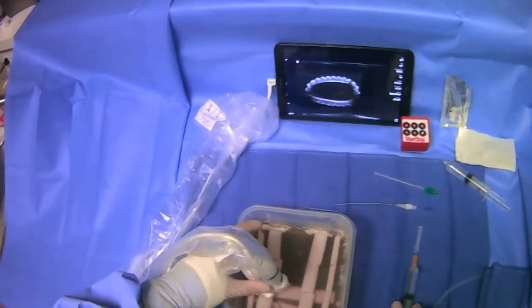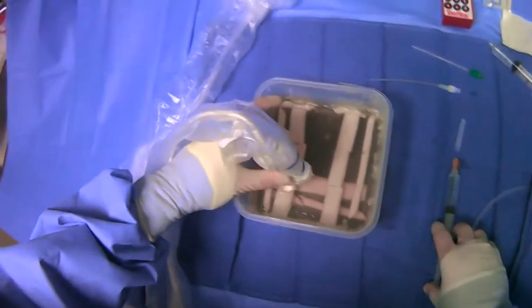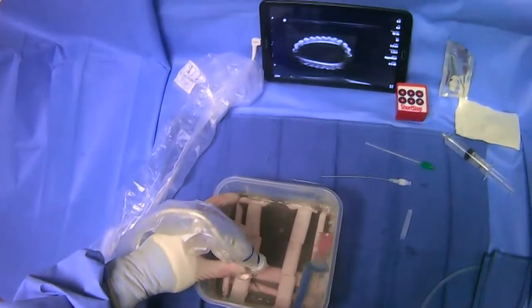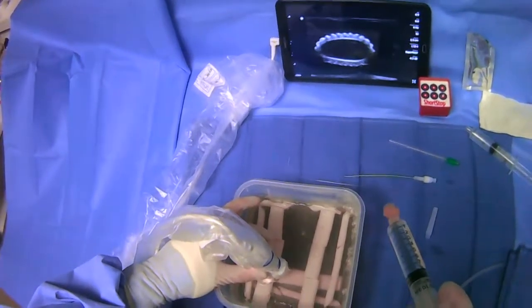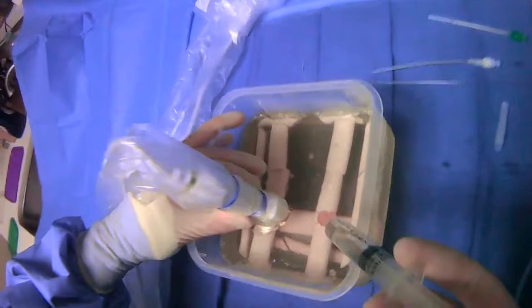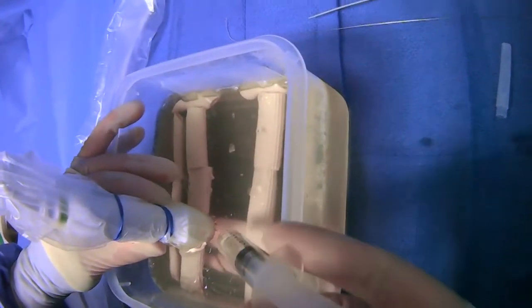What you're going to do is find your target — there's our IJ right there, looking good. Then we're going to grab our lidocaine with our 25-gauge needle. Once we have the target in view, we'll come around the side and go through our dermatotomy.